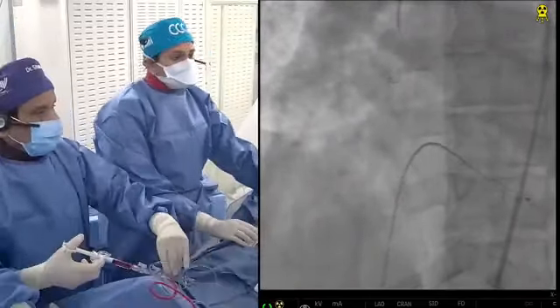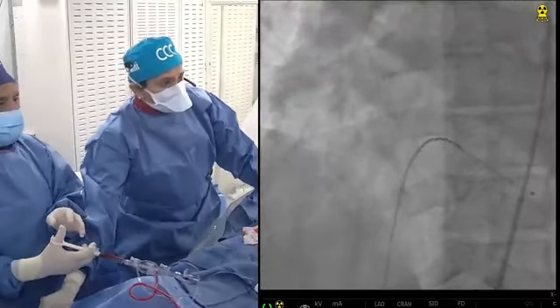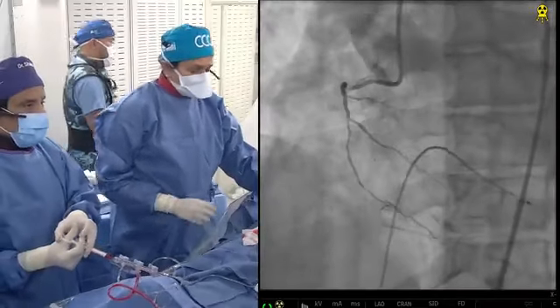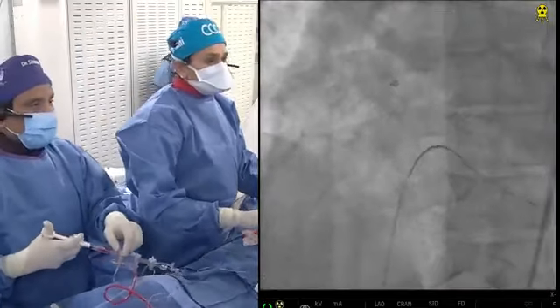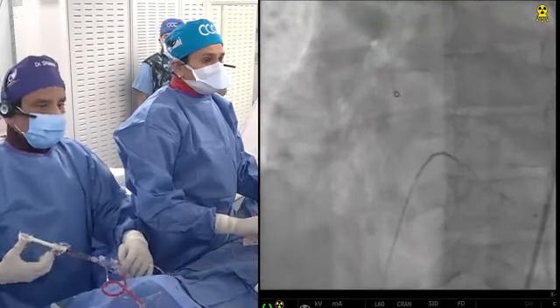Okay, quick, take a picture. You ready? Nitro, a little bit. No need. Okay, now this is a no-torque guide, 3DRC. Go on, come down. No, no, no, that's not the thing, because anytime you do a conus injection, it could go into V-fib. Okay, there.